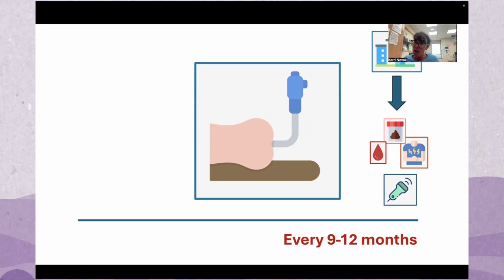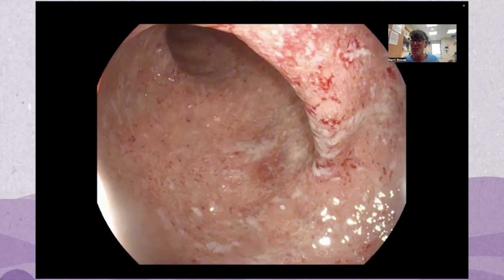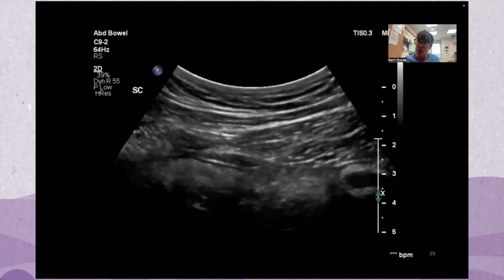For just doing a colonoscopy for activity surveillance to look at whether or not the drug is working, then we can absolutely potentially replace colonoscopy, CT, and MR with intestinal ultrasound and biomarkers. We can do the same thing in ulcerative colitis, and ultrasound is used more and more for both the diagnosis and monitoring of ulcerative colitis.